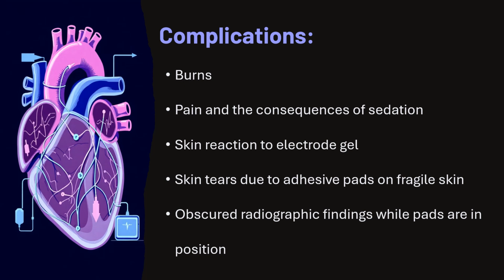The complications: burns, pain, and consequences of the sedation, skin reaction to electrode gel, skin tears due to adhesive pads on fragile skin, and obscuring radiographic findings while the pads are in position. Sometimes we need to see the underlying chest condition in X-ray. It will not appear.